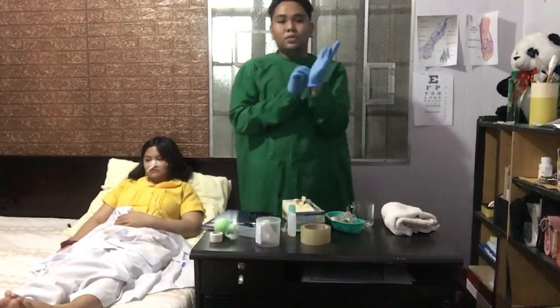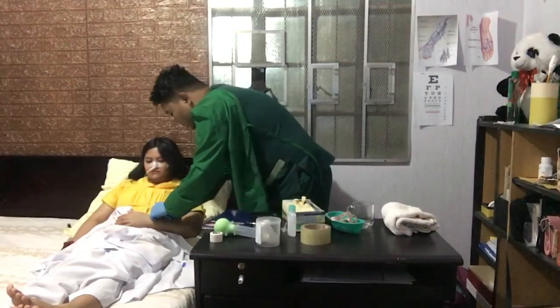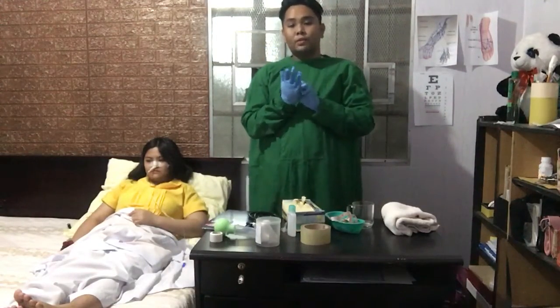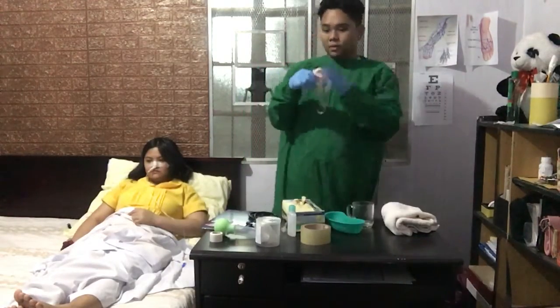Then, after po nun, so unpin po natin yung tube from the patient's gown po. So, assuming na naalis na po, then verify po natin yung position of the marking on the tube at the nostril and measure po natin yung length of exposed tube po using the tape measure po.